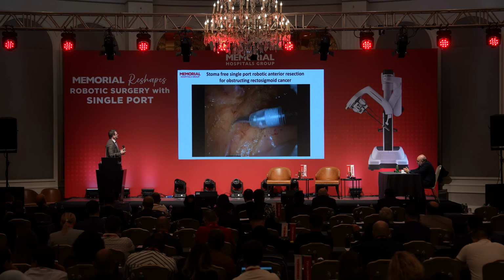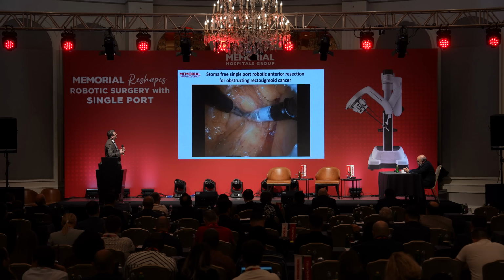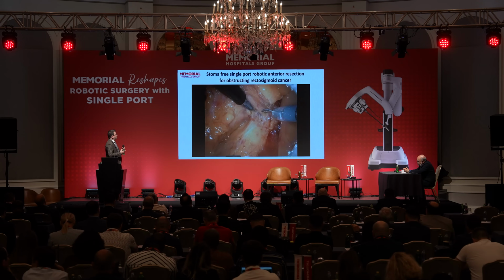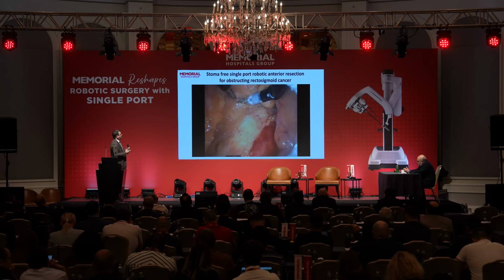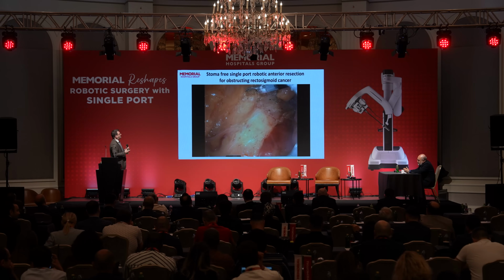They are both acceptable. And in those cases, you realize the edema related to the obstruction, but it doesn't matter. We are following the God-given planes, and then we are doing a completely similar resection to how we do it in open, laparoscopic or multiport robotic surgery.